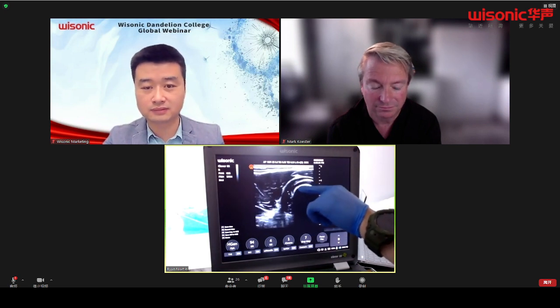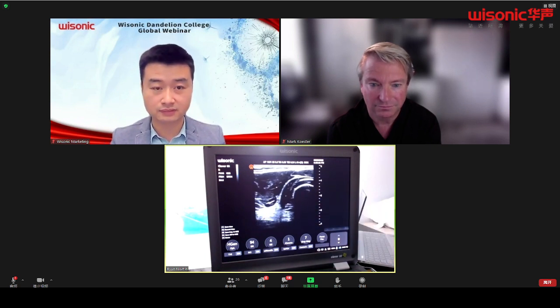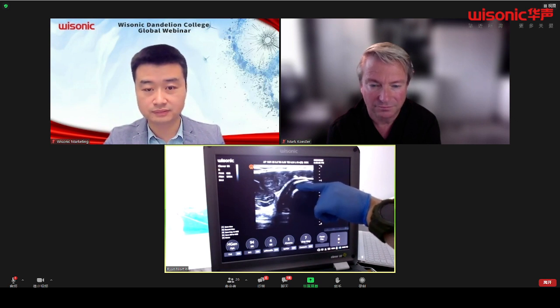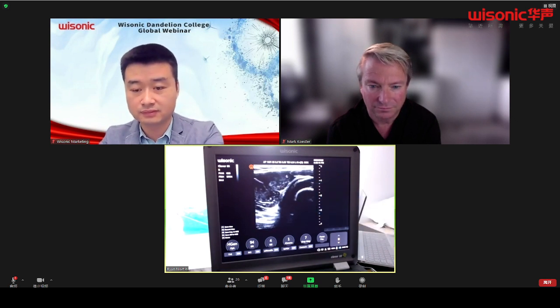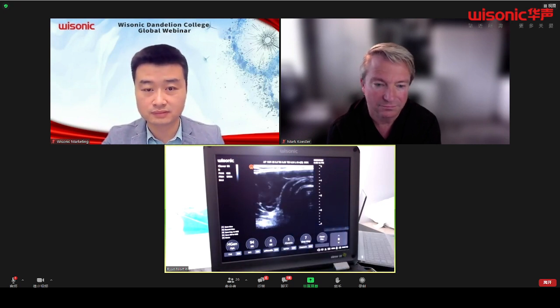And then if you look carefully, you can see the two supinator heads right on top. So go ahead and pronate and supinate, and you'll see those supinator heads move across and that radial nerve right in between it. And just deep to all that, that is your biceps brachii.